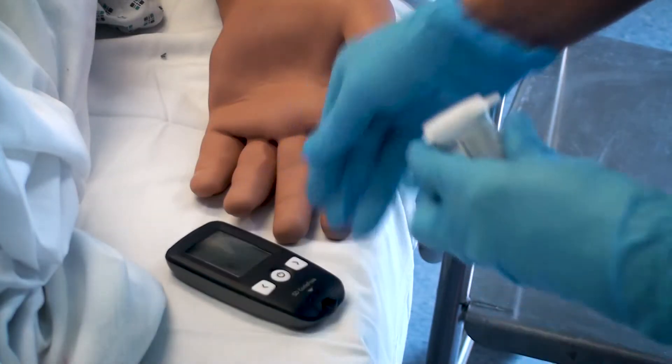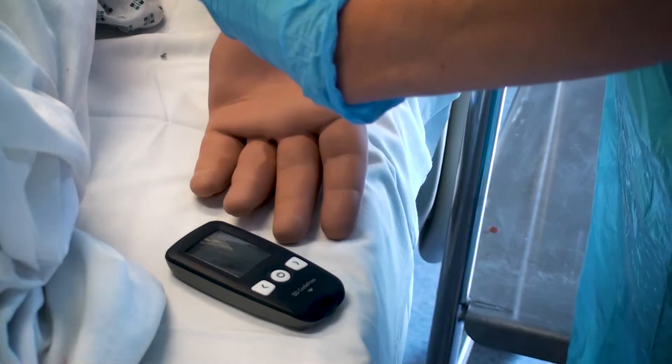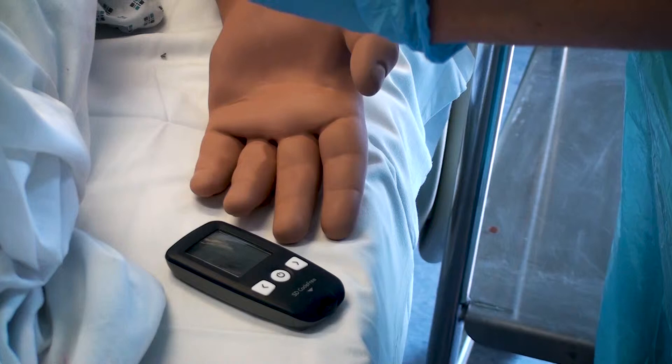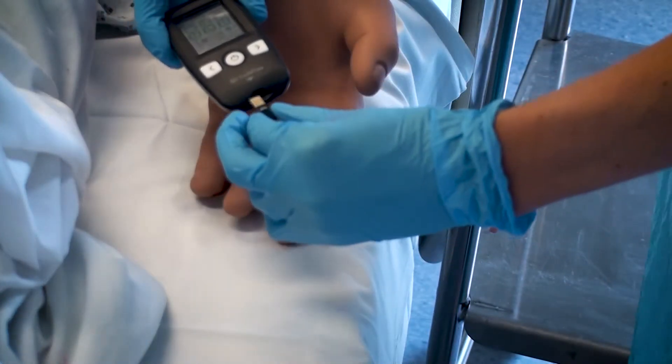Ensure that the patient's hand is in a comfortable position. Prior to obtaining the sample, the digit must be cleaned with water and dried with clean gauze. This is to prevent contamination of the sample by sugary substances from food or drinks. Do not use alcohol wipes to clean the skin.